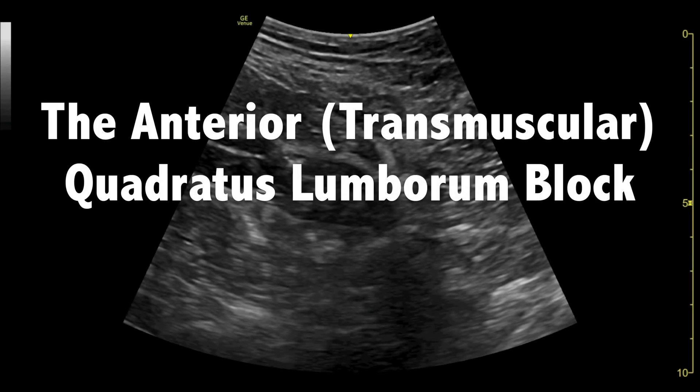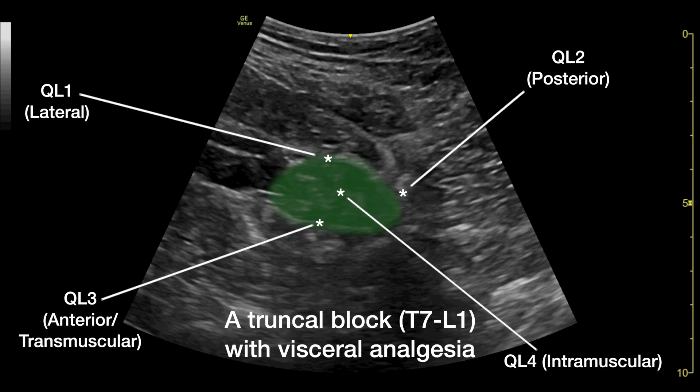This is a short video demonstrating the sonic anatomy and technical performance of ultrasound-guided transmuscular quadratus lumborum block.